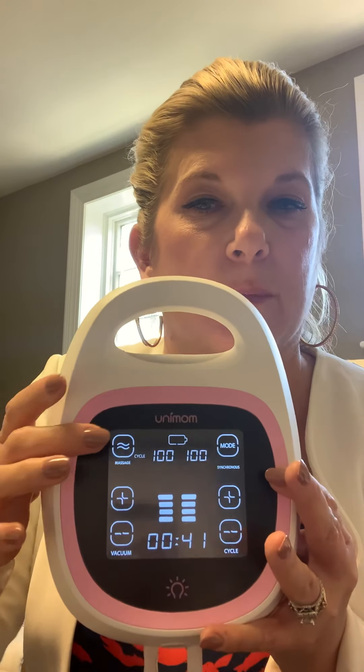When you're massaging, that's your letdown mode, and you can set each mode individually. In massage mode you can set the suction level to be low or high, and you can also set the cycle speed, which can be lower or higher as well. That's always the first mode you want to use when starting with the breast pump.